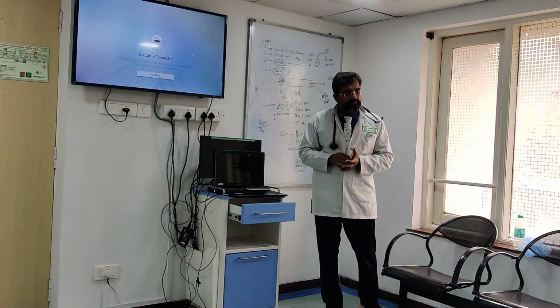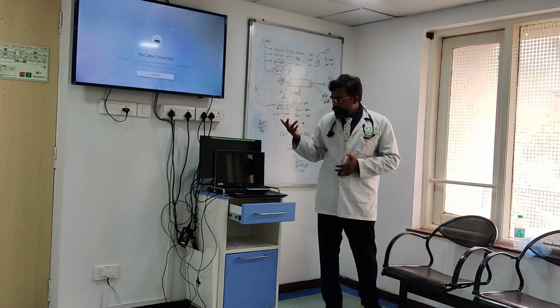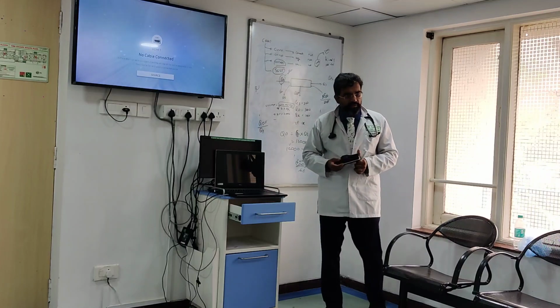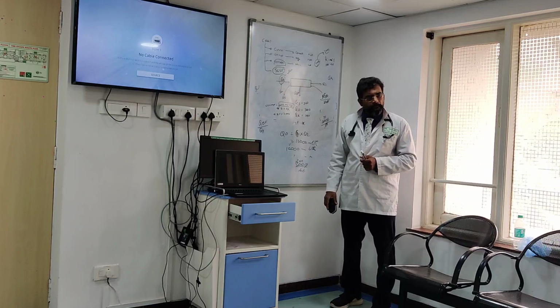समझ में आ रहा है? So somehow I want to increase my amount of diffusion. That's why I'm doing it. Now let's give another example. Okay, I'll give you another example. Any questions? So how, Simon, do we decide dialysate fluid, like replacement QD and QR?